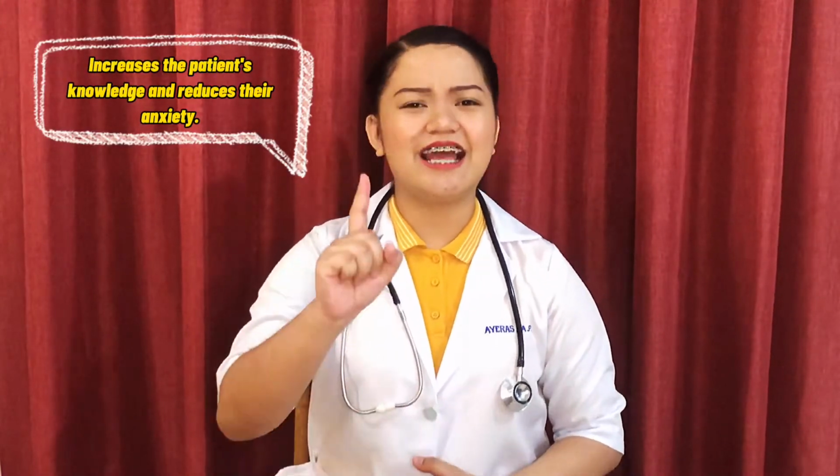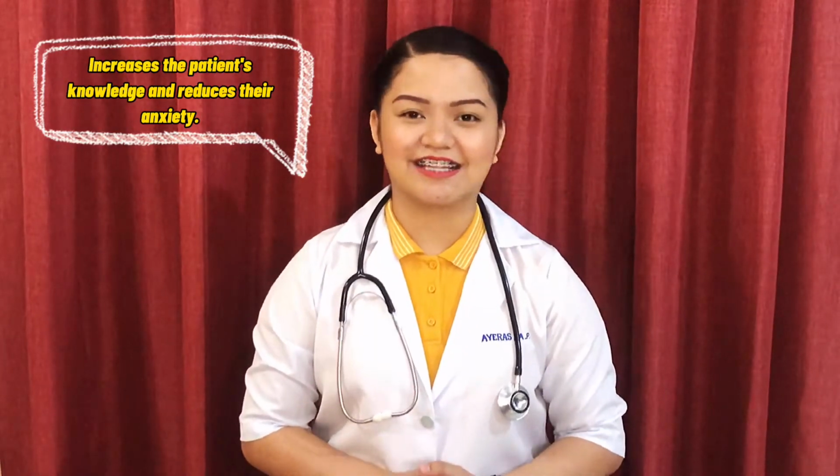Good day, ma'am. Your name, please? I am Irene Malonas. Okay, good day, Ma'am Irene. And this is Aria, your nurse for today. And I will administer you via subcutaneous injection in order to get a rapid and systemic effect of the drug. So, just simply relax and please cooperate. And if you have any questions, don't hesitate to ask me. Thank you. Explaining rationale increases the patient's knowledge and reduces their anxiety.